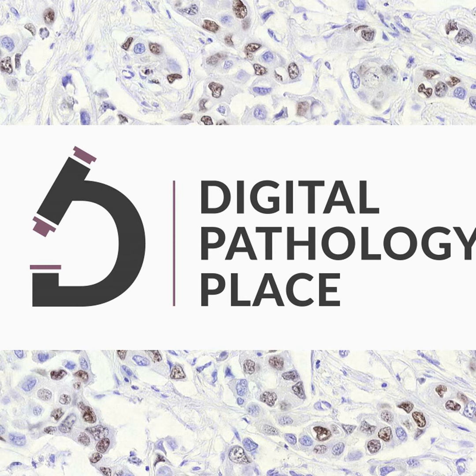And one of the challenges is, of course, that TCGA, which is really the component that we're talking about, is called a DPR, or Digital Pathology Repository. But that DPR is multi-institutional, and that's why there's variability in these slides. Because someone that made slides in New York doesn't necessarily make them the same way in California, doesn't necessarily make them the same way as someone in Michigan, just because of, let's say, small staining times, the particular stains they use, the stainer, the machine itself that they use, and everything affects it, slightly. For example, the temperature in the room, the humidity in the room, all of these have some type of a chemical component effect on the underlying stain, which affects the ultimate presentation.